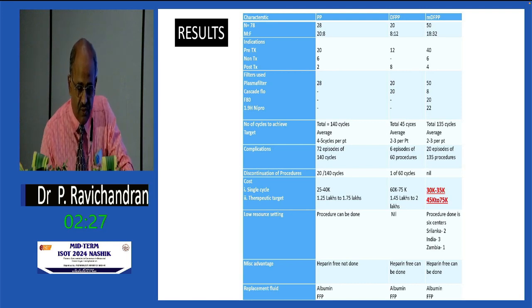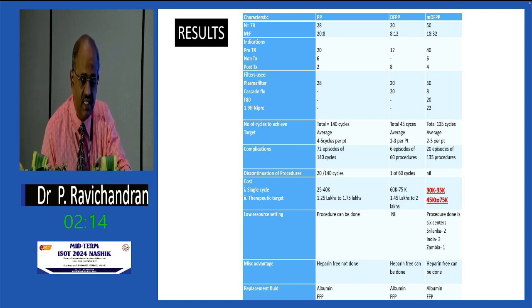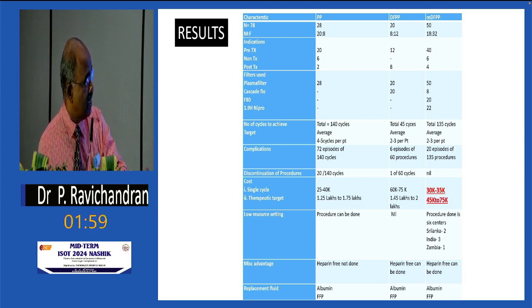So results: out of 78 patients, 50 patients underwent the modified procedure. We compared with 28 patients of plasmapheresis and 20 of DFPP. And women were more in DFPP basically because they were highly sensitized and we had to desensitize them. Most of the procedures here we were doing in a pre-transplant condition, but even in non-transplant and post-transplant, whenever DSA was going up, we used to do it. And the common filter used in all was a plasma filter, and in DFPP it was cascade flow. And most of the time we were using Nipro 1.9H or F80 Fresenius.